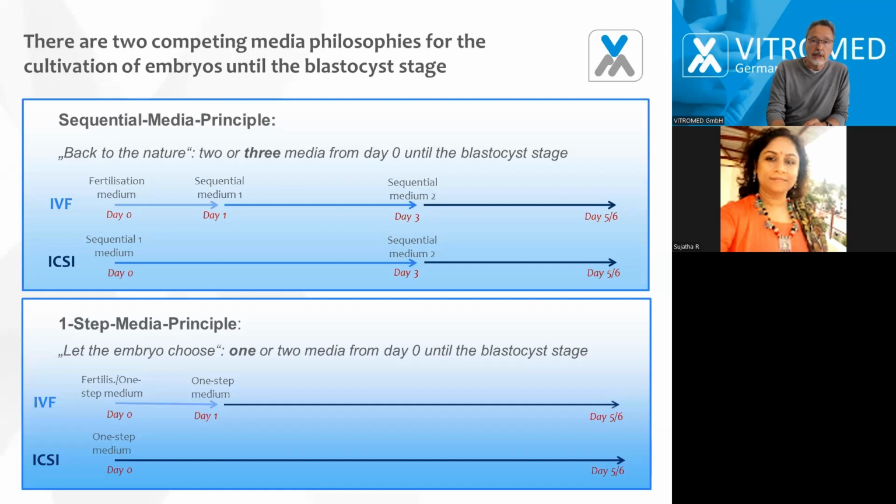The second principle is the one-step media principle. It is based on the let-the-embryo-choose philosophy. That means that the medium offers everything the embryo needs, and it can decide by itself which components it needs and uses.